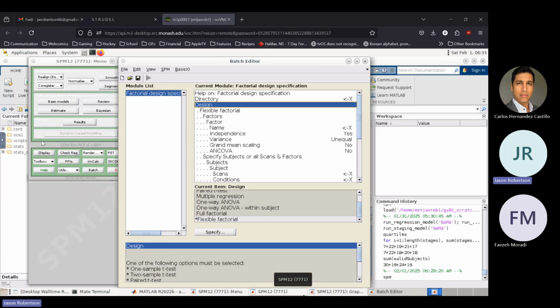Basically, going back to this equation, by including all the sites and all the other covariates that we want to control for, we're getting more and more weights here because it has to account for the effect of all those different variables. And so that's how it sort of removes the effect of those variables, by having to account for them in the model and then not including them in our final calculation of what's significant.